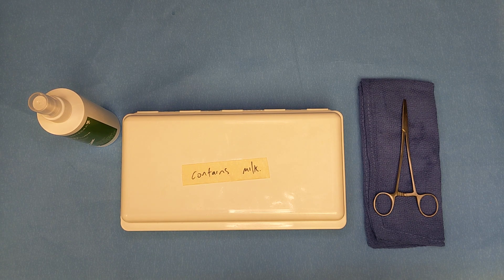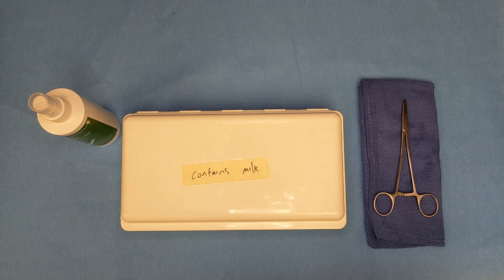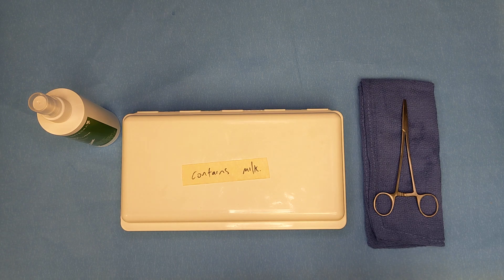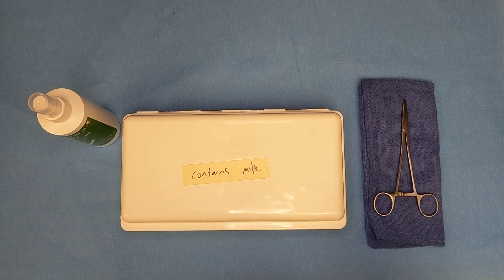Today we're going to learn how to manually lubricate an instrument. Instrument lubrication, sometimes called instrument milk because of its white color, is applied to instruments with moving parts to ensure their ongoing function and reduce wear and tear over time.